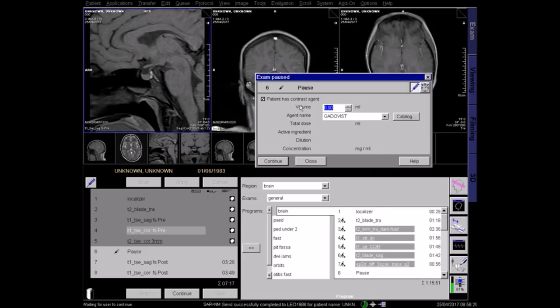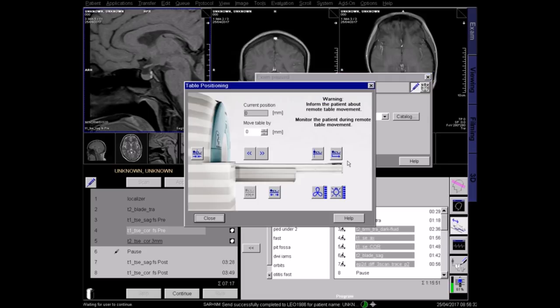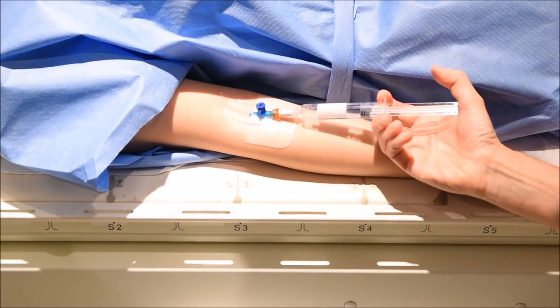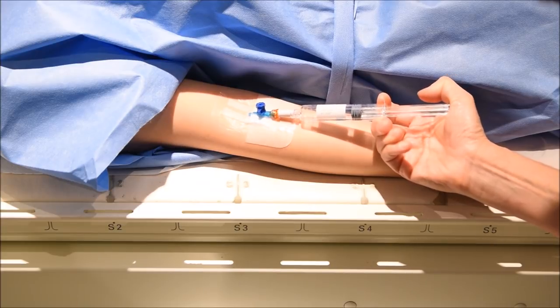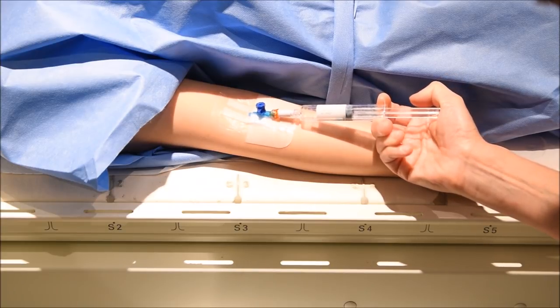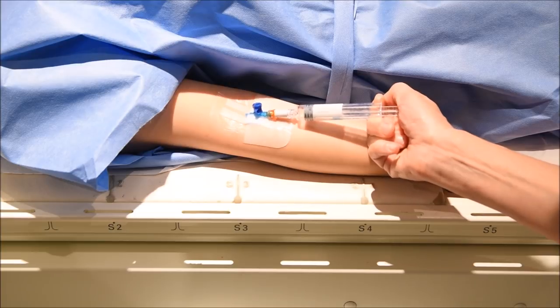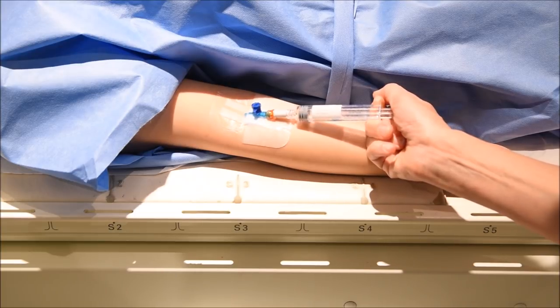Once the pre-contrast images have been acquired, enter the contrast volume and the name of the contrast medium. Bring the patient out, reminding them to lie still. Inject the contrast according to the manufacturer's guidelines. Check that the contrast is not tissued or extravasated and that the patient is feeling well before returning to the control room.